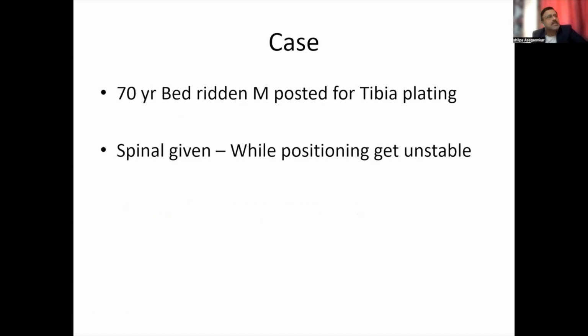Now, this is a 70-year-old male, bedridden for 8 to 10 days, now posted for tibia plating, and spinal given. Our orthopedic friends are very keen on cleaning the patient's limb, so they took adequate time, maybe half an hour, to clean his lower limb. And by that time, the patient suddenly became unstable during this procedure.